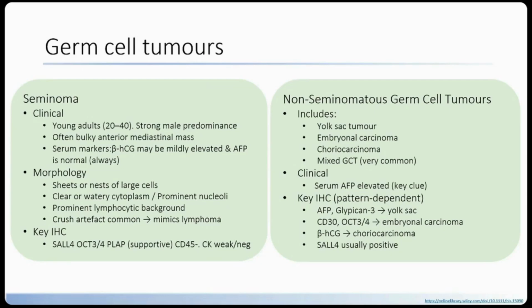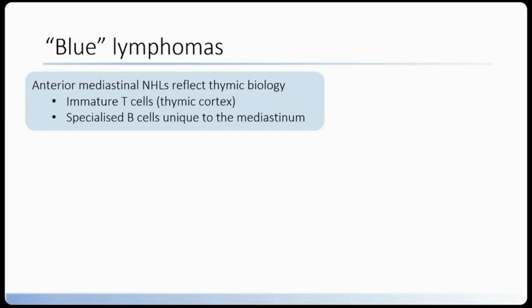That context of teratoma is always one that is challenging, and obviously if you've got a mature teratoma, make sure that you've examined the lesion very thoroughly to make sure that there are no immature components, or that you've got somatic malignancy arising within those teratomas.